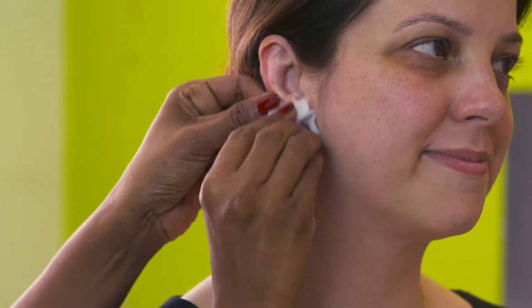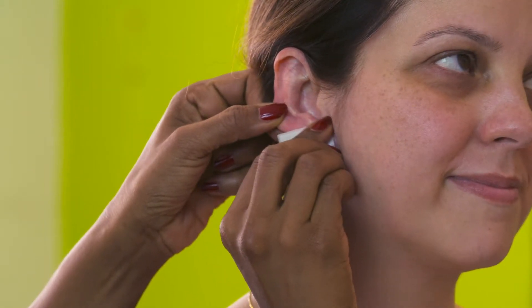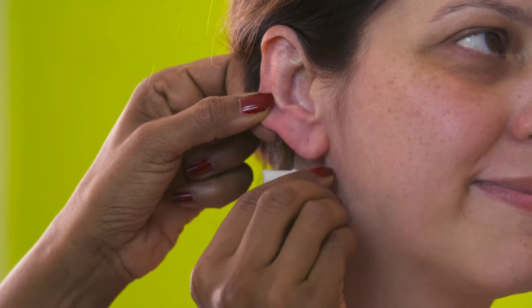I'm going to demonstrate on Amna. First I'm going to start by cleaning the ear with an alcohol wipe to ensure that there is a good seal of the clip onto the ear. Alcohol takes about a minute to dry, so leave it to dry while you start to prepare the ear attachment clip.